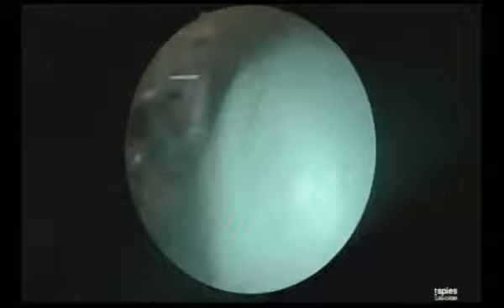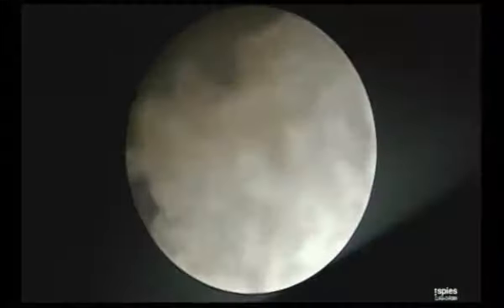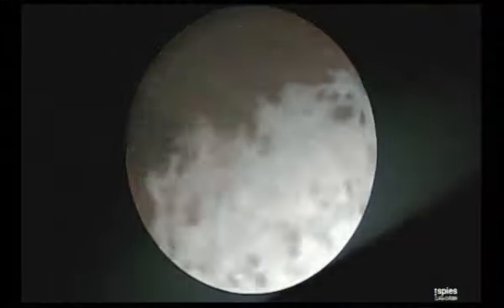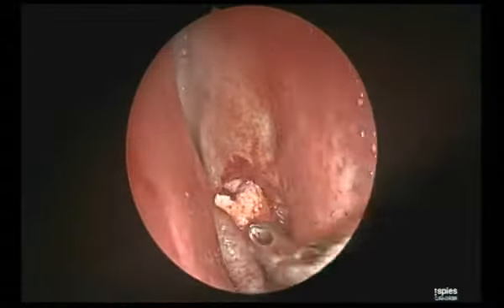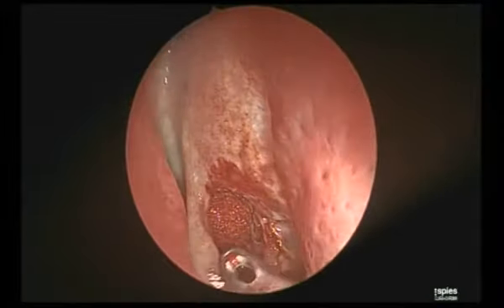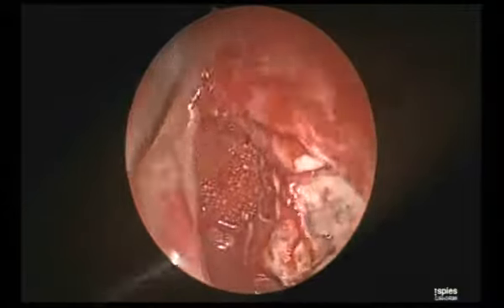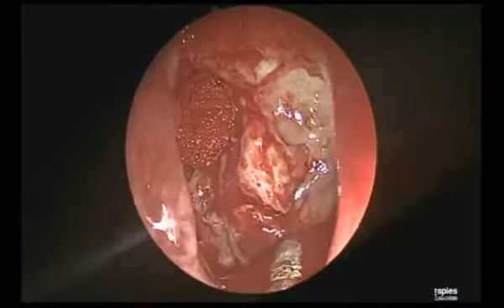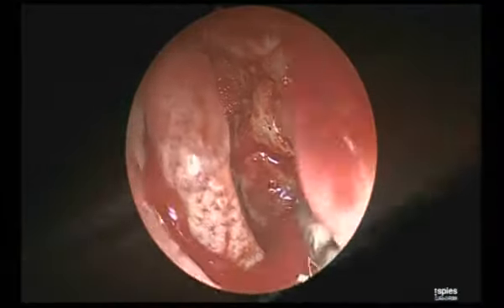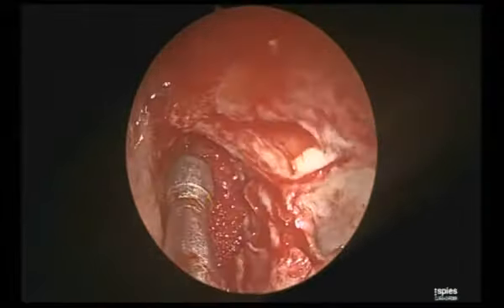Don't get confused with the intersinus septal cell from the beginning, that it is going to give us a tough time. It can, but you need to know what this cell is. This cell always opens in one of the frontal sinuses. So why are you bothering about that cell unless you reach the frontal sinus? This is not going to open in the frontal recess directly. It is going to open in one of the frontal sinuses, and you can easily pick it up once you see the frontal sinus. Go medially and look for the cell.